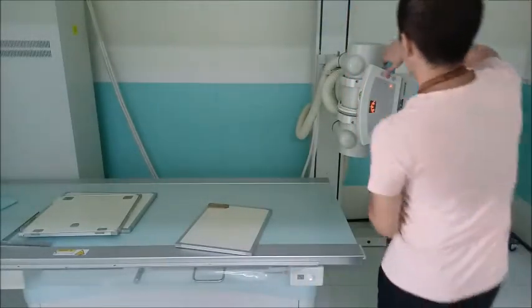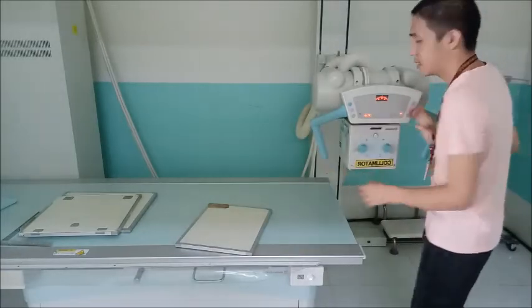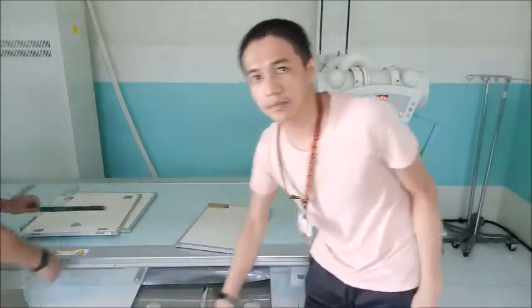So what do we do if we examine on the table? Okay. The X-ray tube should be placed perpendicular to the table.